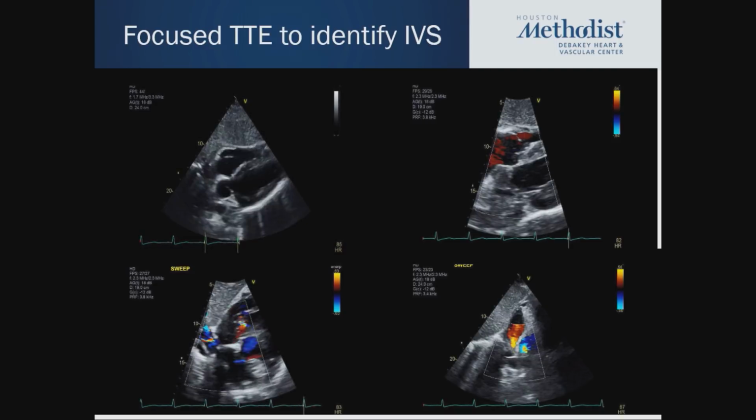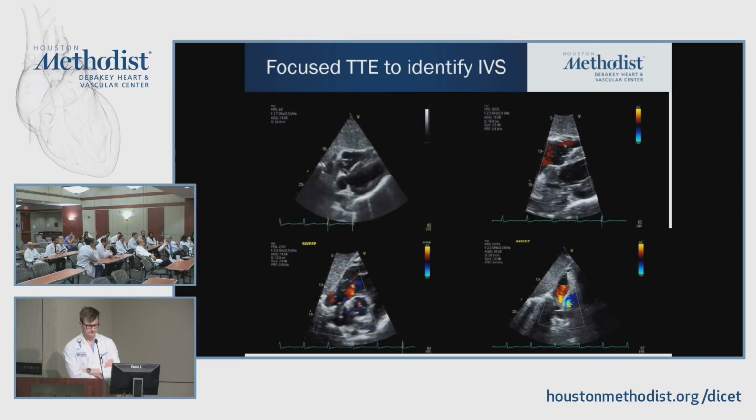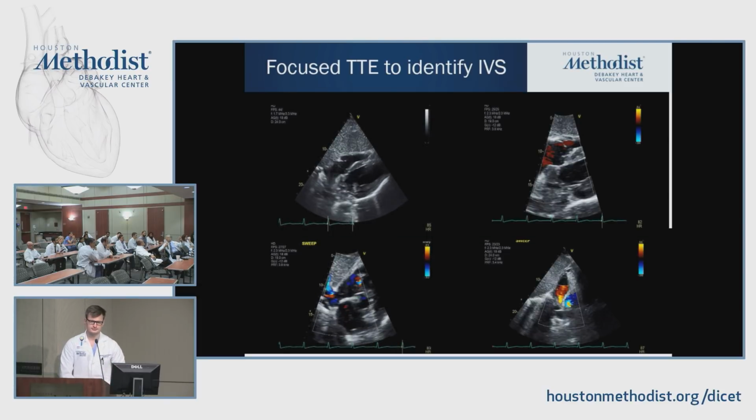In this situation, since it's not emptying, diastole and systole are about the same, so you may see a little tiny flow at very low velocity, because they are at equal pressure. This tiny chamber has the same pressure as the LV, be it in the LV outflow tract or a little further down. So it is high pressure, and that's why you're not seeing any color Doppler, or you may see a little nudge, which is usually very brief. By contrast, on your CTA, once it fills, it's filled. You may have a little trickle or swirl in it, but that's about it.